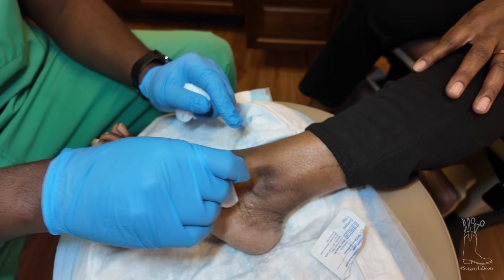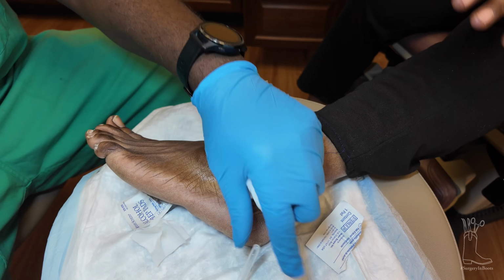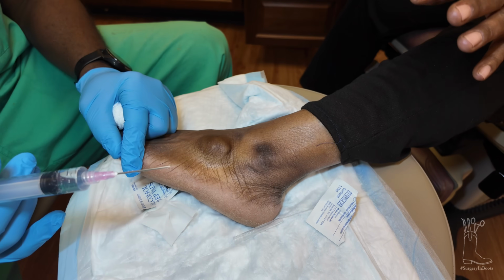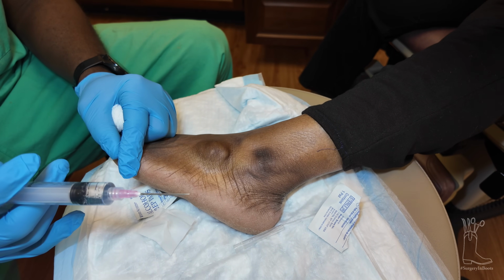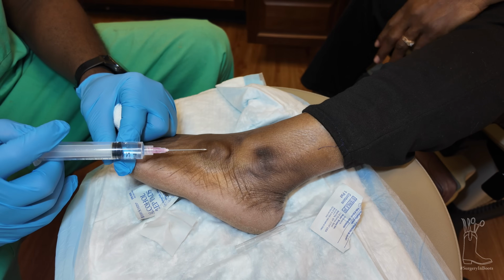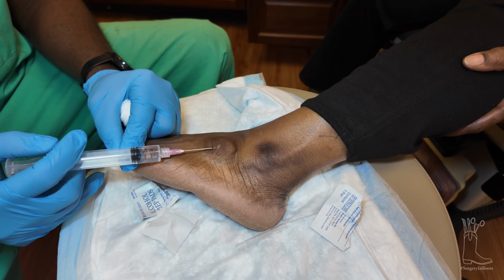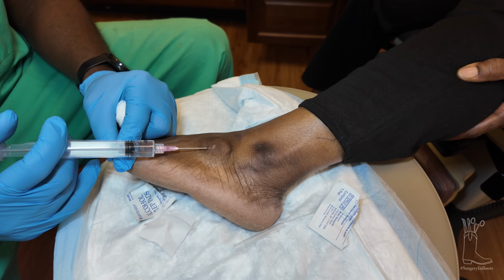And then after that, we will... I don't know if I can call my other daughter. Hold on, what you doing? Okay. A little stick. You ready? Yeah. 1, 2, 3. There you go. So we're going to put a little numbing medicine on it.